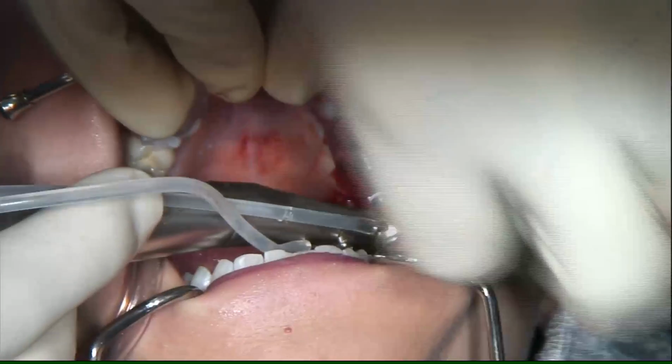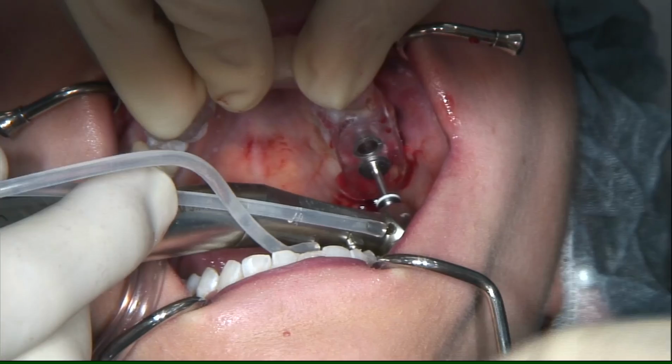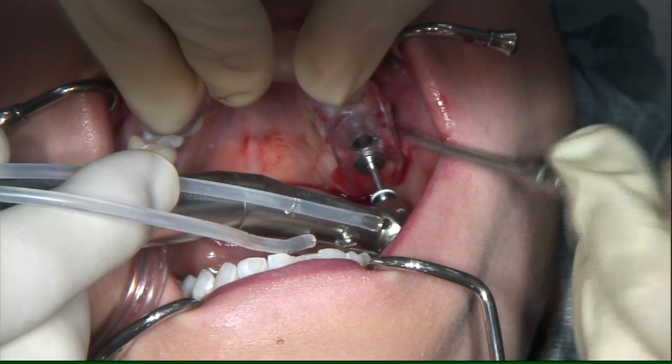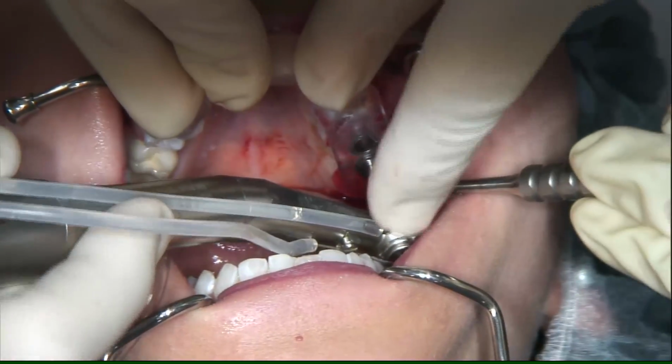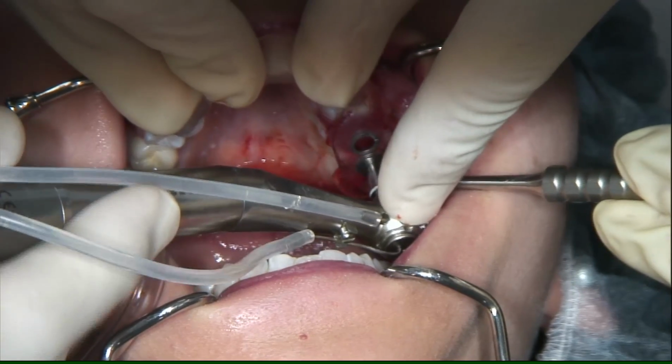Okay, 2.5 is finished, so we are ready for placing the implant. Now we go to area 2.6, starting with the pilot drill again, which has a diameter of 2 millimeters.